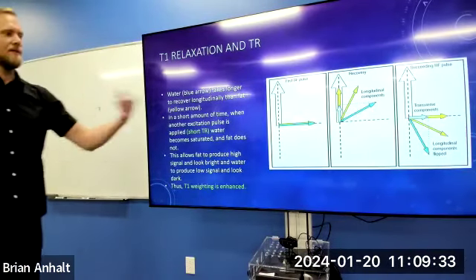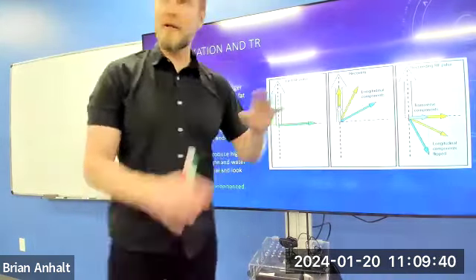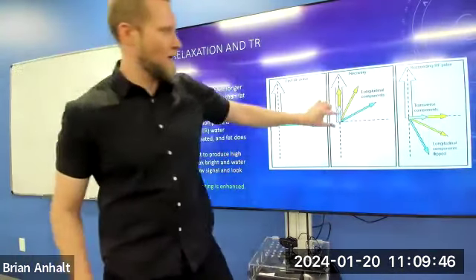I don't love this. This is straight out of the book. It does show you your longitudinal component, but I like to look at them as separate, right? I don't like to look at this vector going down here. But you can see your longitudinal component, right?